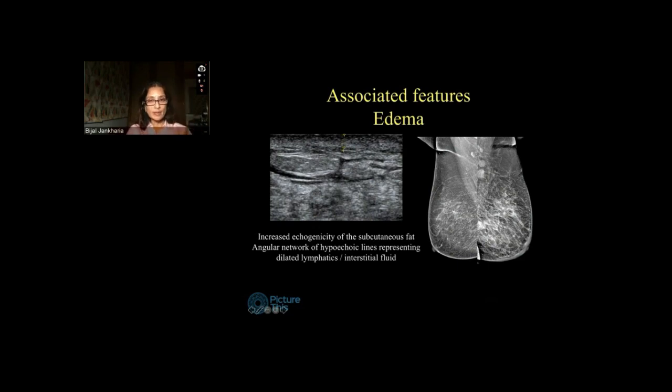Here everything is continuously hyperechoic, and that is a sign of edema. There is also an angular network of hypoechoic lines which represent dilated lymphatics or interstitial fluid.